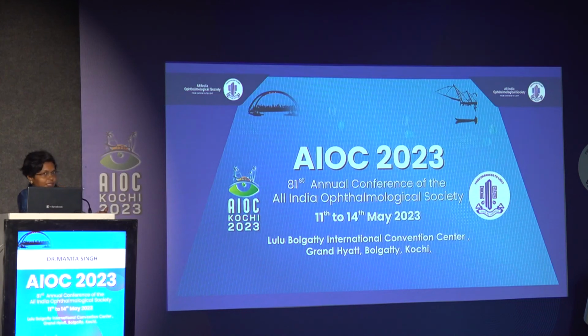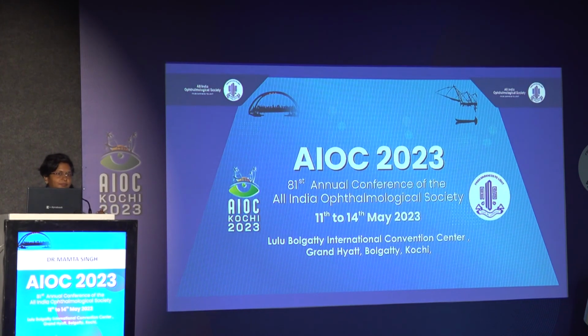I think AIOC Patna has got a serious dry eye module, I guess. You want to say something, Dr. Rakhe, on what added information those give regarding the aqueous film and tear surface? We have a topographer, and in that machine we have non-invasive tear break-up time, and we can measure it easily, as well as do meibography.